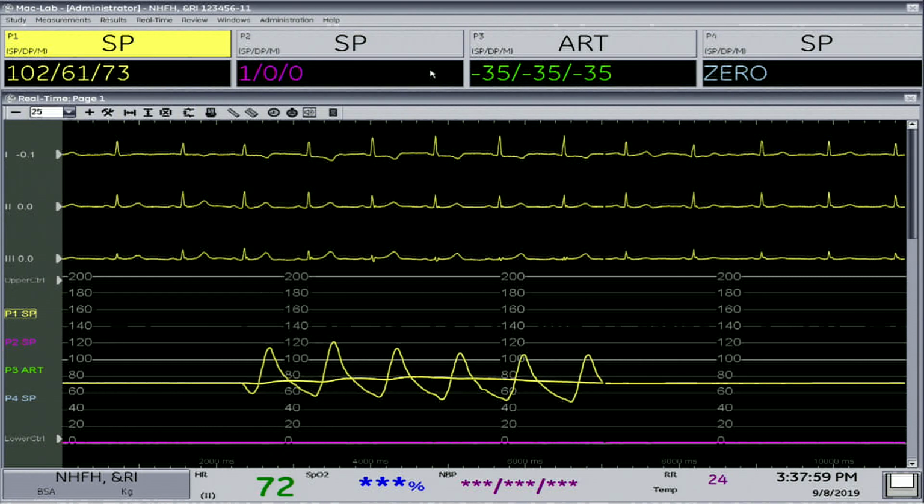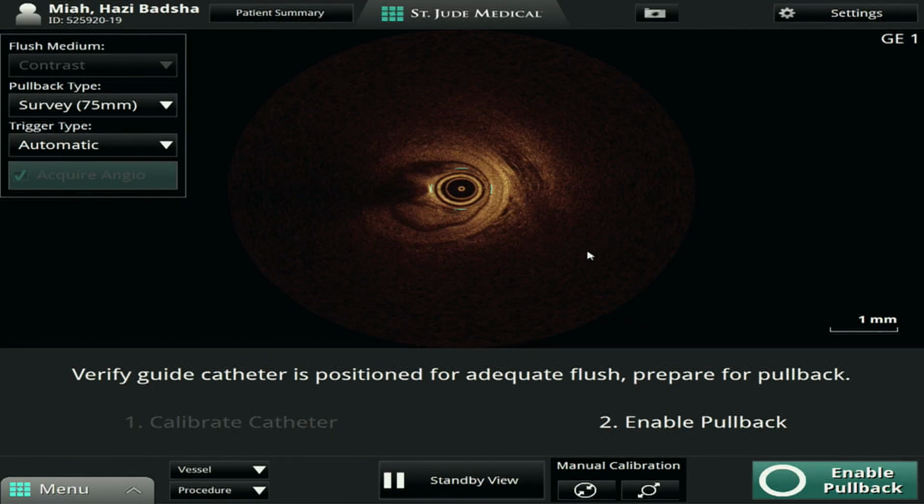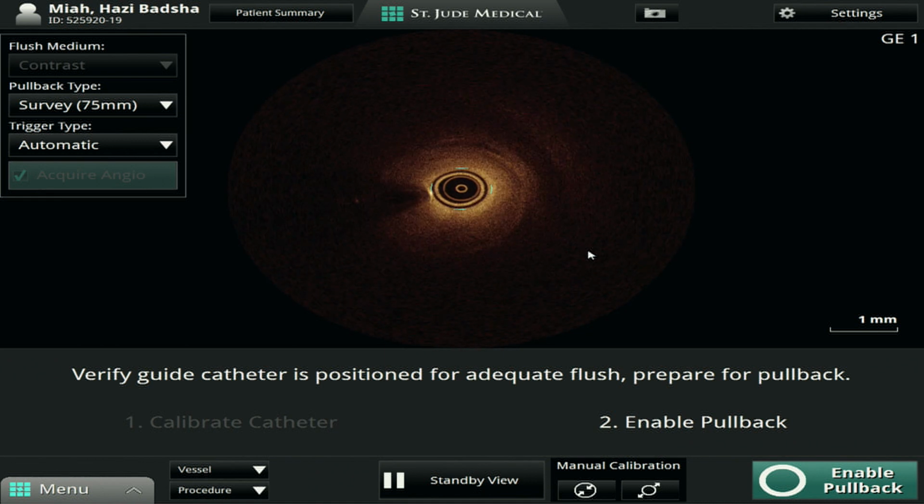Okay. And now this is concentrated dye. Ideally, it should be 20 ml of concentrated dye. Here we are giving 10 ml. It should be a luer lock syringe, right? Yes. Fully concentrated dye. And Qayyum, being a very strong guy, he's going to do the pushing.